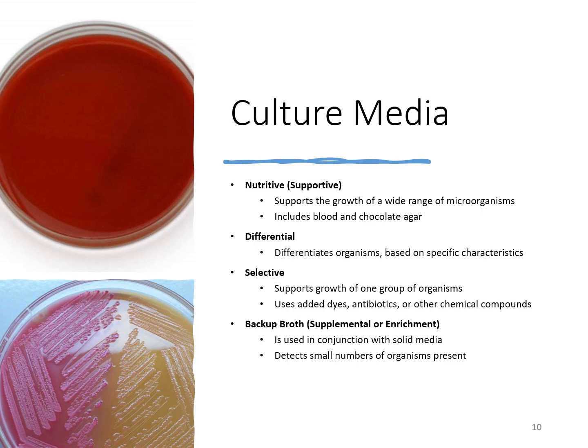Then it kind of helps to enhance that growth of those small organisms. And so sometimes something like this may be set up on, like, a vaginal culture, for example, in which it would allow for an enhancement of growth of those organisms. And then that broth itself can also be cultured or gram stained as well.